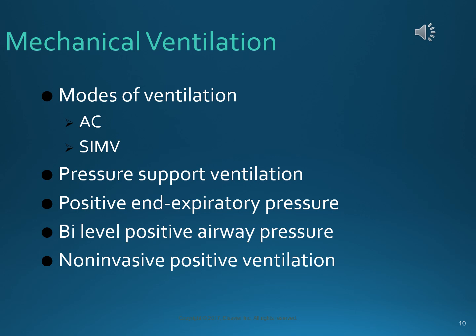with damaged lungs. PEEP is positive end expiratory pressure. What this is, it's positive pressure at the end of expiration. It keeps those small airways open, keeps them from collapsing, which is atelectasis, and so keeps them open for more gas exchange. Once they've collapsed, it's way harder to pop them back open again. And so the key here is keeping them open so that you don't have to do the work of popping them back open again. It just keeps more area open for gas exchange.